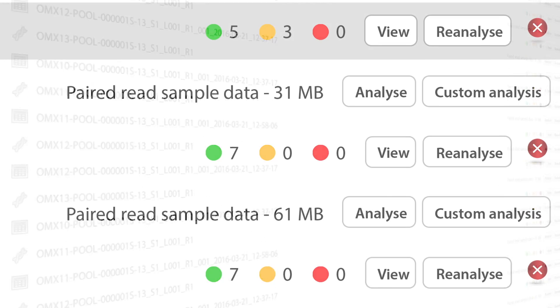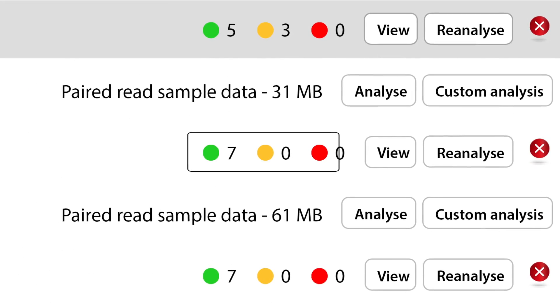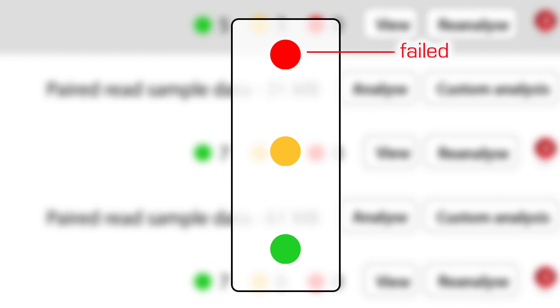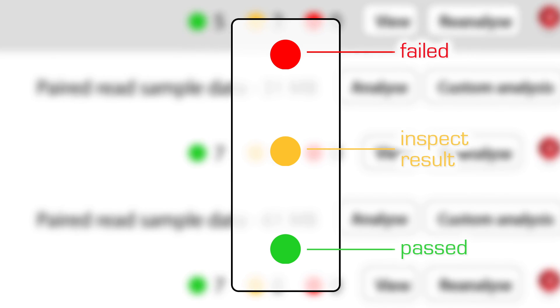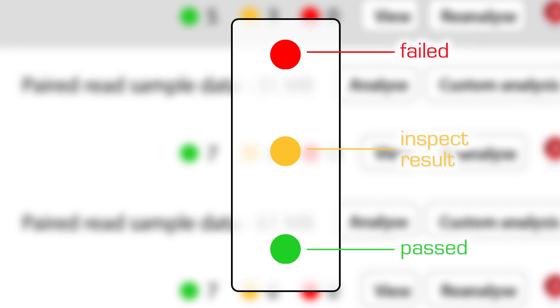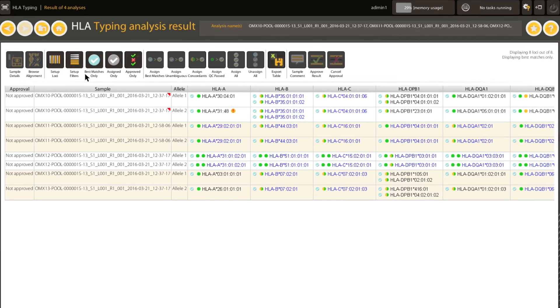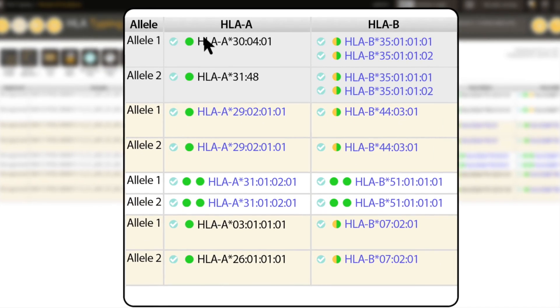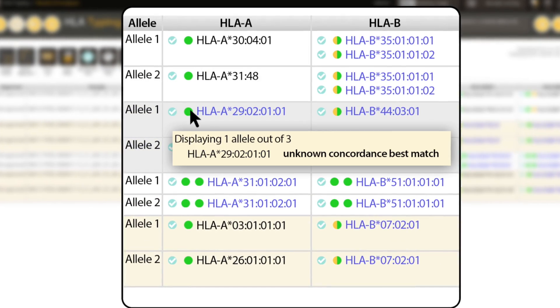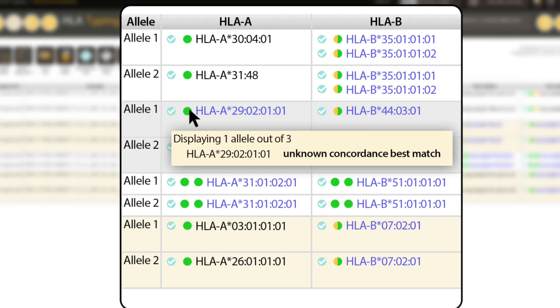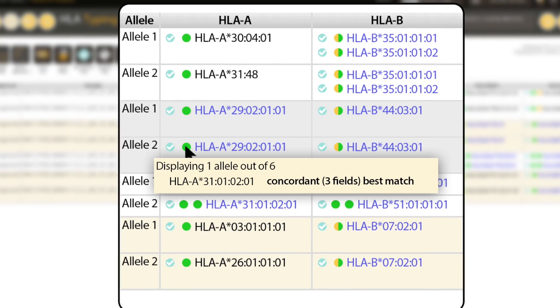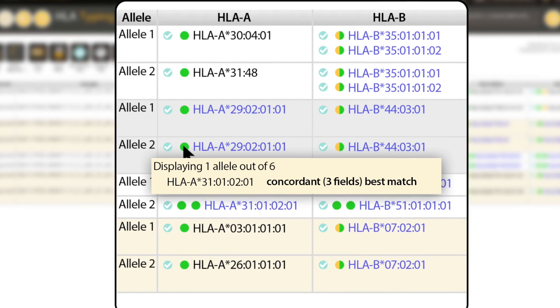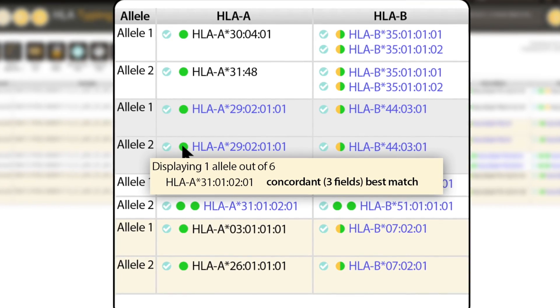When viewing results, the traffic light system allows you to accept good results with confidence and guide your attention to those results that really need it. The traffic light system is a significant time-saving innovation that provides information about both algorithmic results and quality control metrics.